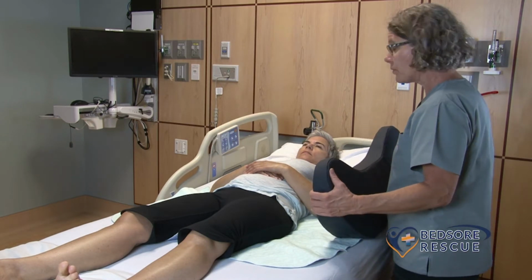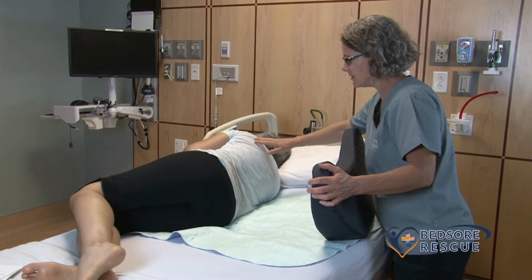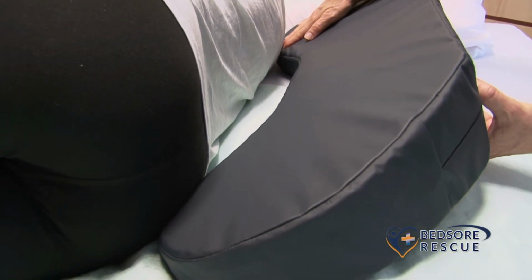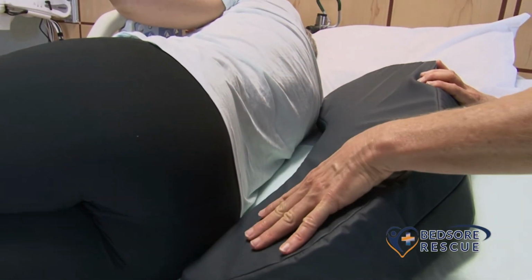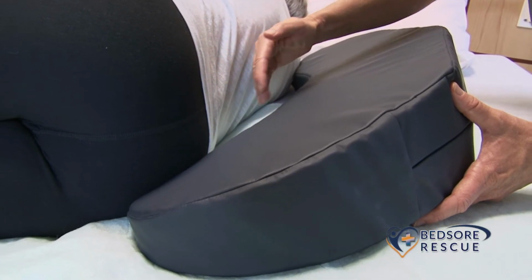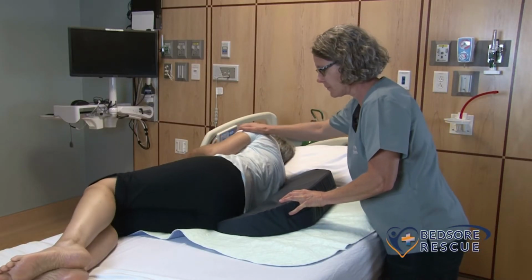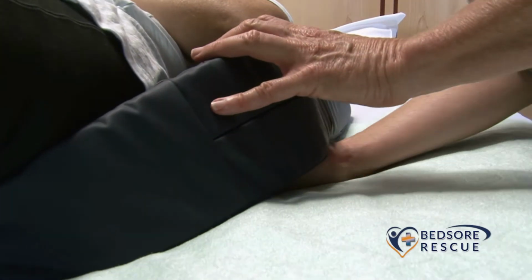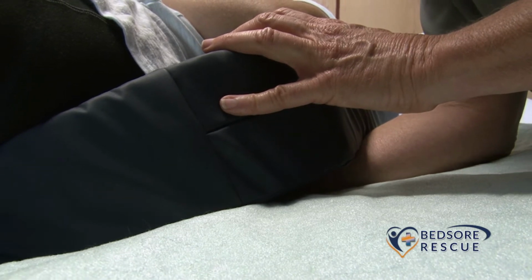It's easy. Using proper patient handling techniques and good ergonomic principles, have your patient turn as far over as possible on the side. Tilt the angle slightly so that you can place the top part of the cushion under the scapula here and the round part under the buttocks. Notice how the wedge will support the buttocks area, but the contouring will actually be away from the sensitive sacral coccyx area and actually away from the whole spine. As the patient turns back on the cushion, there, comfortable? Yes. You may want to check for proper placement by slipping your hand under the wedge to feel and make sure that there's no direct contact with the sacrum and that it's got a little distance off the bed.